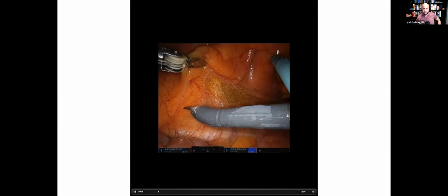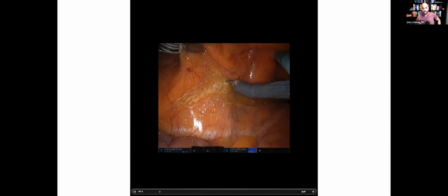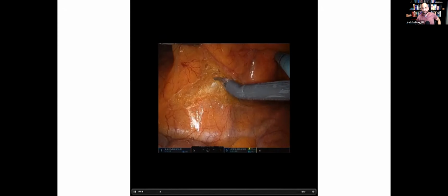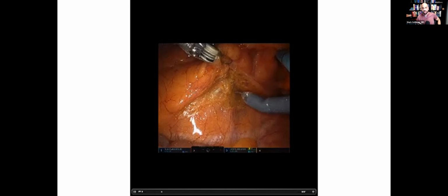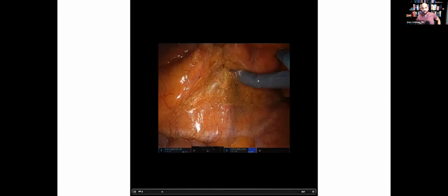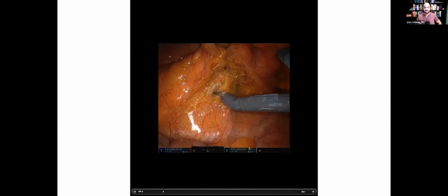Get into the presacral space first, finding that areolar tissue plane, heading now north, and essentially scoring the peritoneum. And this is what Dr. Bastaros will do. Dr. Bastaros talks about scoring, a little too deep there. Dr. Bastaros talks about scoring the peritoneum from the level of, man, did he get the ureter there? Or is it the iliac? What is that? Oh, geez.